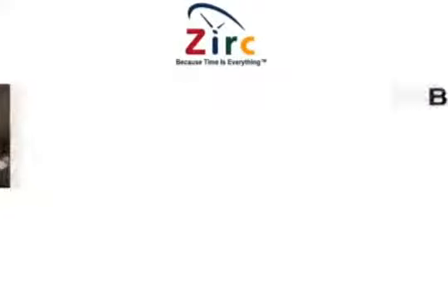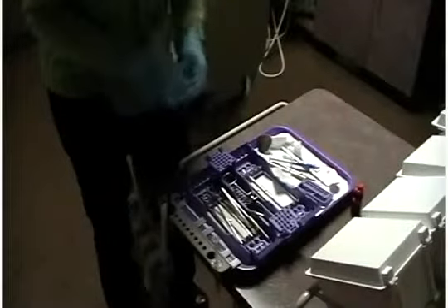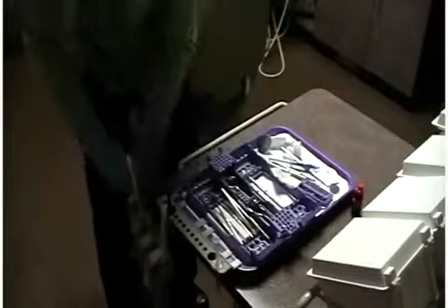Breakdown. The procedure is complete, and now it is time to break down your setup.